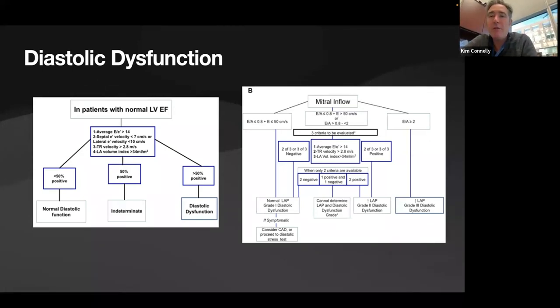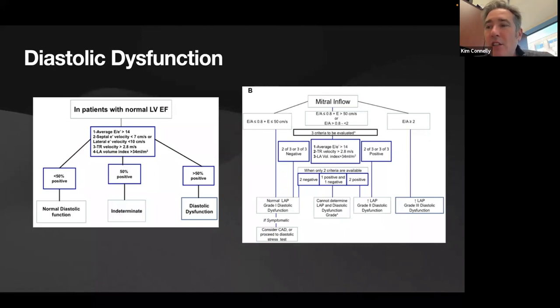Yeah, I was just going to remind everyone that Fotis focused on diastolic dysfunction, and that diastolic function is not the same as diastolic filling. Diastolic dysfunction is not the same as heart failure with preserved ejection fraction. In the new universal definition of heart failure, remember that you need to have a number of criteria: symptoms and signs, as well as an elevated BNP, as well as echo evidence of abnormalities that support the diagnosis.